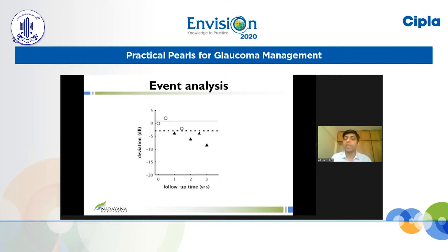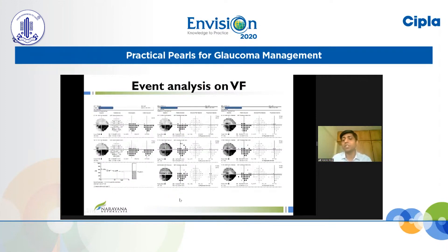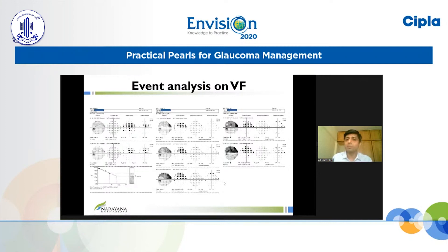The other method is event analysis, where follow-up examinations are compared with baseline examinations and a change in a parameter of a certain magnitude — based on predefined thresholds — is considered as progression. The event analysis on visual fields is based on the EMGT trial criteria, where a point whose threshold sensitivity has changed by a magnitude greater than the test-retest variability seen in stable glaucoma is considered as progression. Here is an example of an eye that has been stable over time, with the message 'no progression detected.'